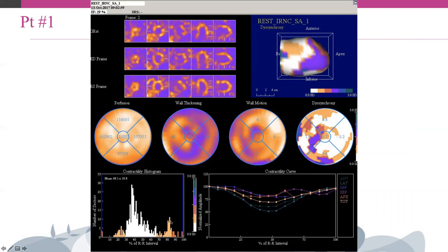In the absence of myocardial dyssynchrony, the phase polar map is uniform and the phase histogram is narrow — which is not the case in the example shown. In addition to the graphical representation by means of a phase polar map or histogram, at least two continuous measures are available for absolute quantification of synchronicity: the phase standard deviation and the histogram bandwidth. This patient with LV dysfunction shows clear evidence of intraventricular dyssynchrony, as seen in the curves and histogram.